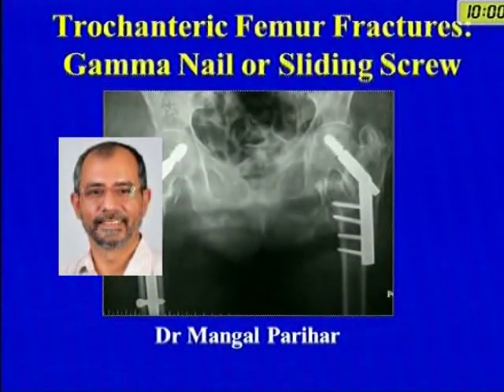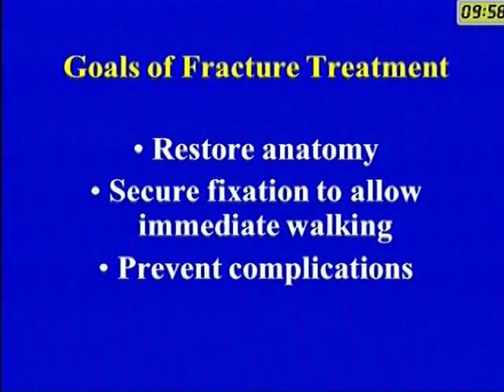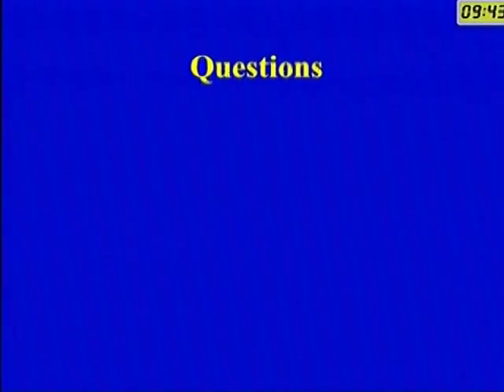Flavor of the month again: leave the old DHS and get in with nailing. All the big boys do nailing, but is that really true? So the goals of any fracture treatment are, one, to restore your anatomy; two, a secure fixation to allow early or immediate walking; and three, to minimize or prevent any complications.